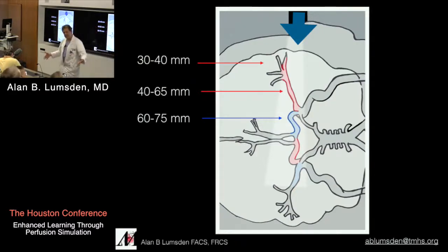And it's very important to device companies because they can put in a branch thoracic endograft, and the single biggest limitation is going to be stroke. Some places run a 20% stroke rate. You've got to know when the stroke is actually happening, okay? And so that's the advantage of being able to monitor this in real time.